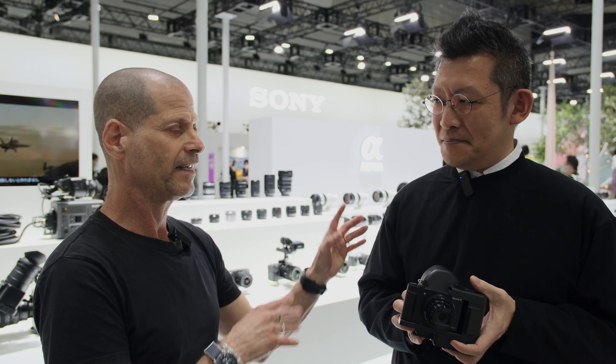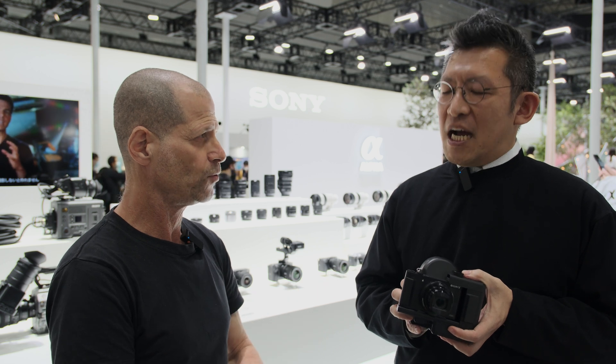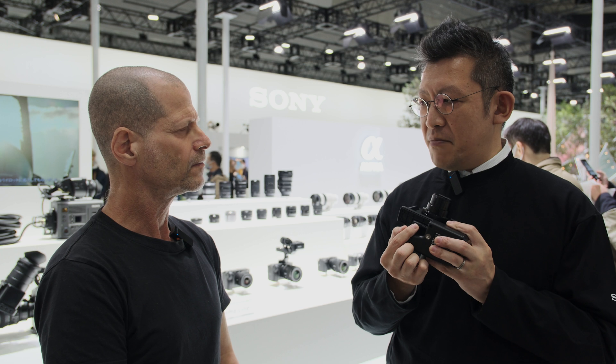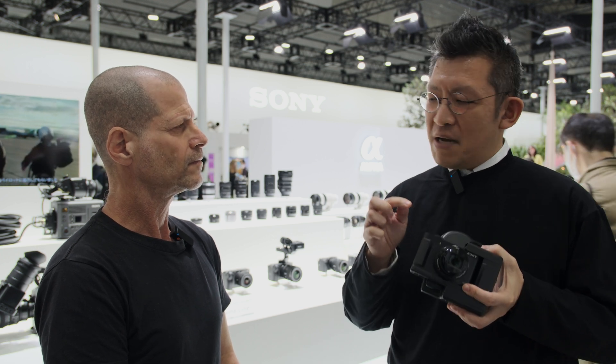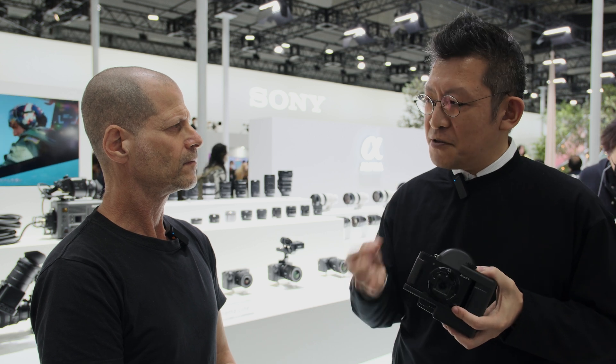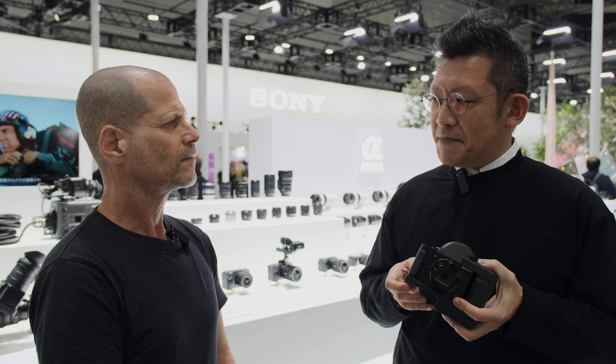I know this is not really a politically correct question, but theoretically or practically, can you use this device with other cameras? Actually, yes. This viewfinder has an HDMI connection, so any camera with HDMI output and a through-output function — it works actually.